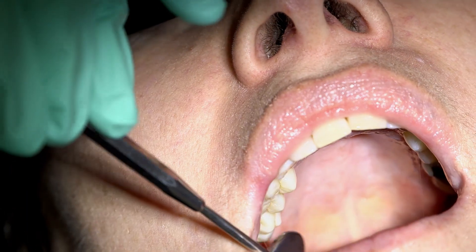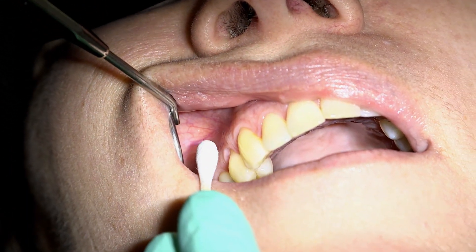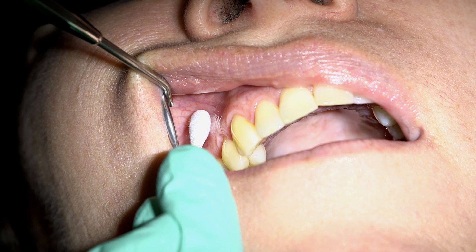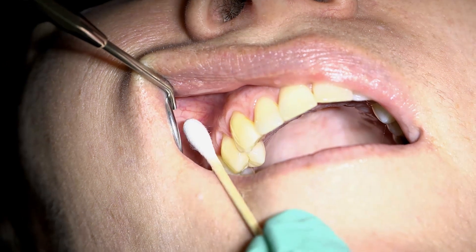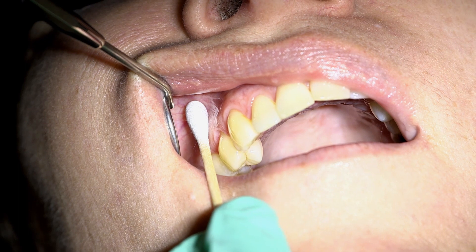For buccal infiltration of tooth 1-4, the target bony site is slightly distal and superior to the apex of the target tooth. You also need to identify the soft tissue landmark — for the buccal infiltration you are aiming for the height of the mucobuccal fold of the vestibule adjacent to the target tooth. Your syringe should be oriented so that it is parallel to the long axis of the tooth.